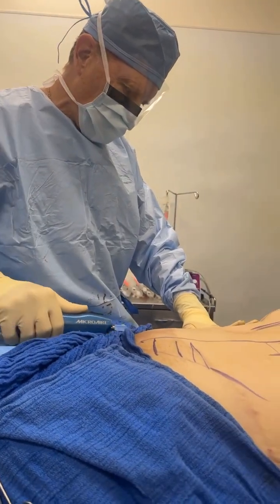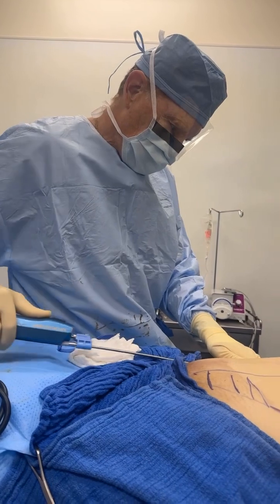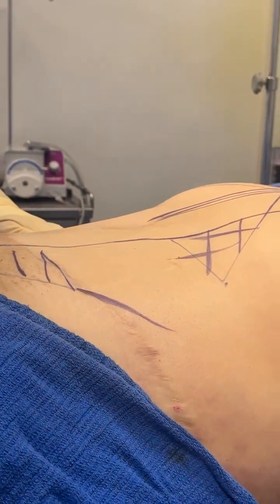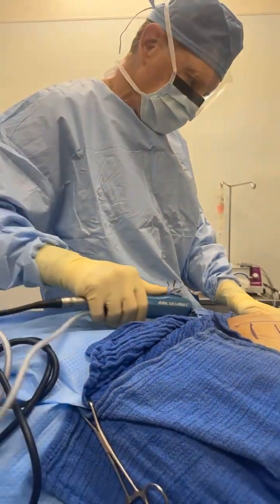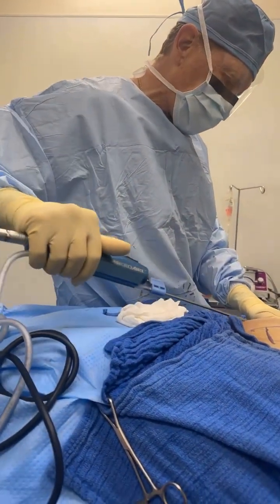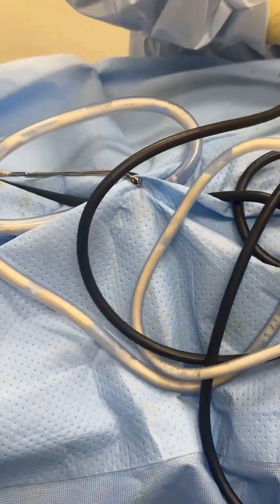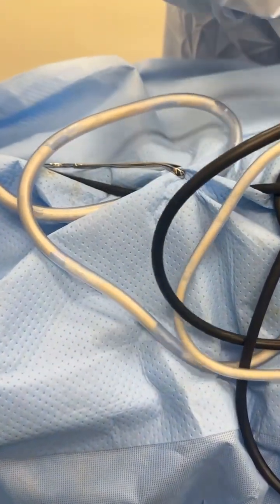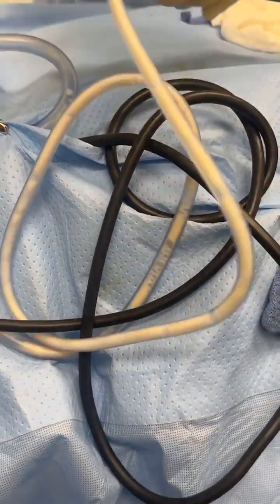Wow, that's very good. So what about the speed of my stroke? So it's a good consistent speed where you're being careful not to bruise or cause any harm or striation during the lipo, so that post-op, you have a smoother look when you're recovering. Is my stroke faster or slower than the other doctors you've seen do this? It's not really about speed as technique, right? We don't want to injure the skin, injure the muscle, and we want to make sure we're in the right area. So good consistent speed, you're actually at a rate that's kind of faster, which is good at the same time because less time in the area, less trauma.